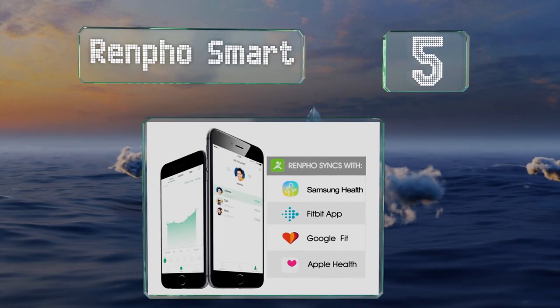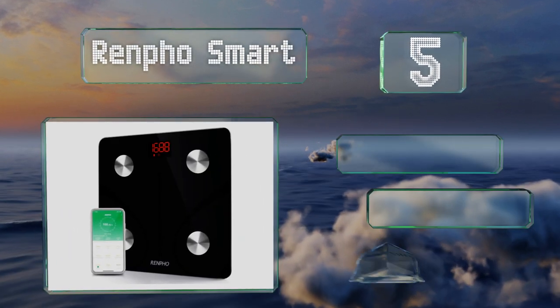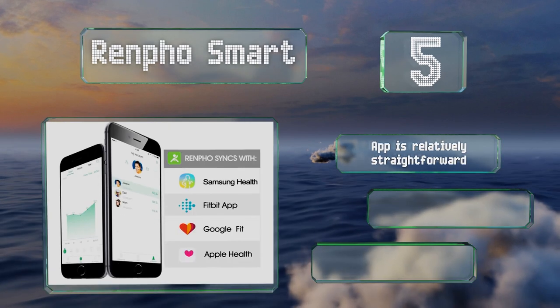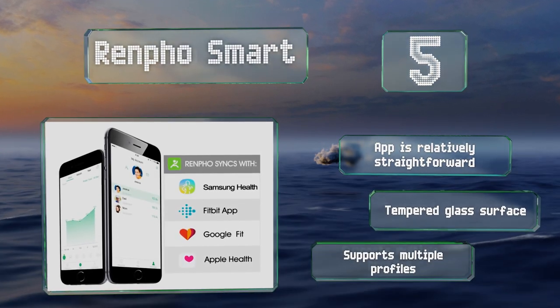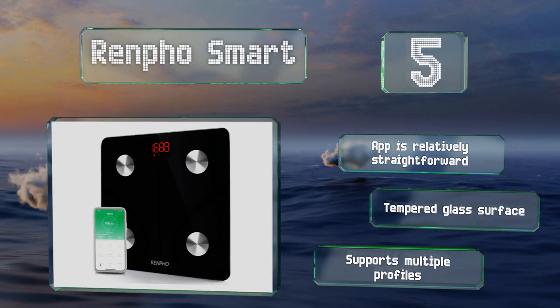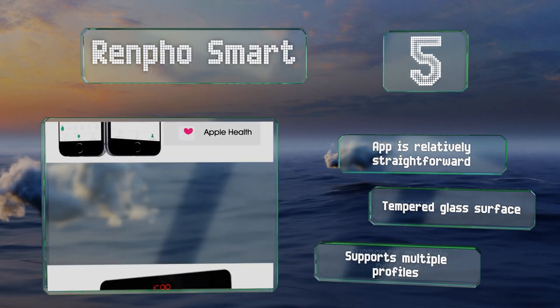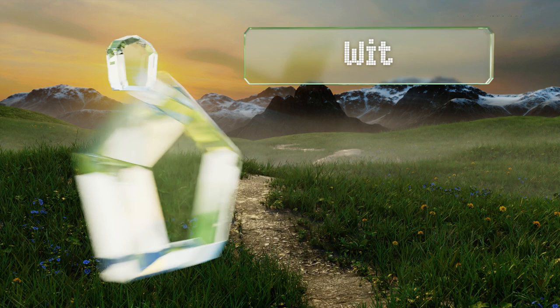Halfway up our list at number five, if you can't bear to be far from your health data at any time, the Renfo Smart employs Bluetooth to pair with your phone or tablet. It monitors 13 helpful metrics including BMI and metabolic age, so you'll never be able to use ignorance to excuse your fitness levels again. The app is relatively straightforward, it has a tempered glass surface, and it supports multiple profiles.